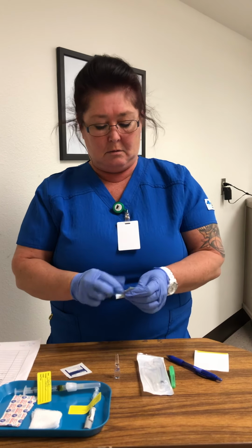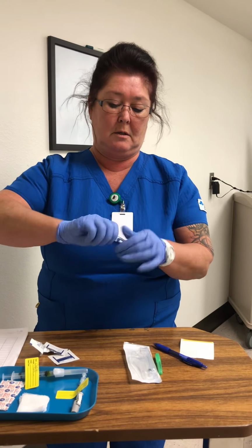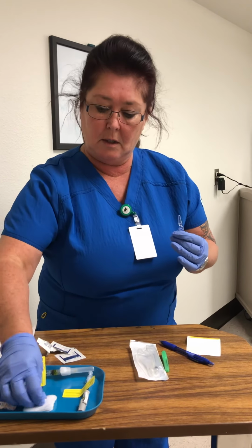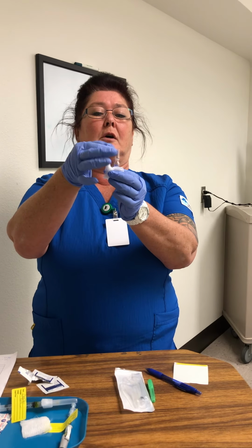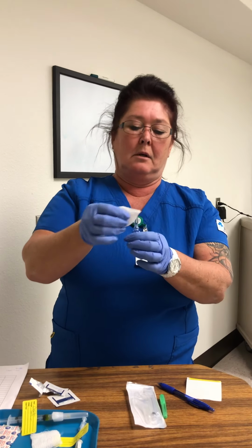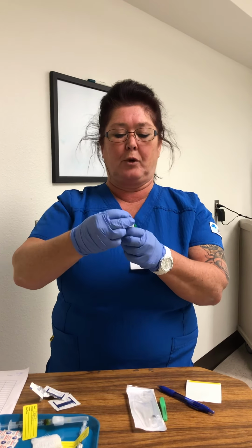So first thing I'm going to do is I am going to disinfect. And then I am going to take my 2-inch cotton square after I tap everything down to make sure there's nothing in the top. I am going to put this around, and I am going to pull this towards me so that the glass breaks away from me. And this would be discarded into a sharps container.